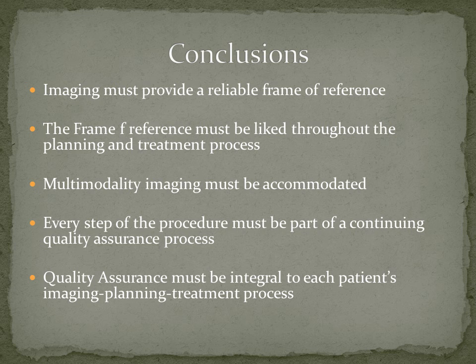And again, what you see on a given day, tomorrow when you get ready to do DBS, today when we get ready to do radiosurgery, the few minutes of imaging, the few minutes of image processing is the tip of the iceberg. If that's 20%, there's probably 4 times that amount of time being put into making sure all of these systems are lined up and accurate and stay that way.